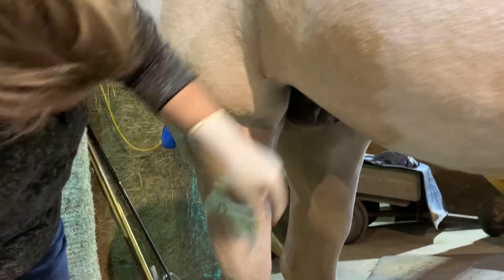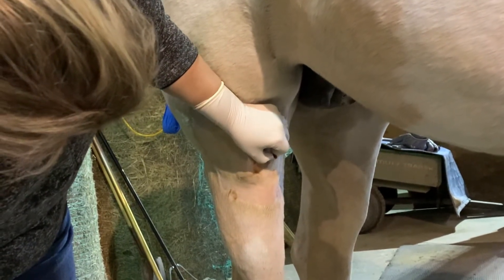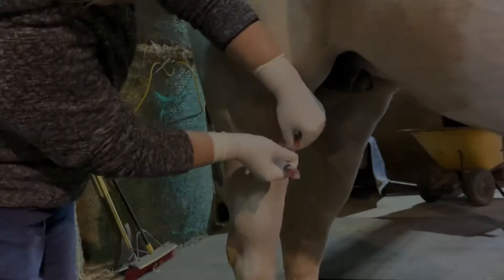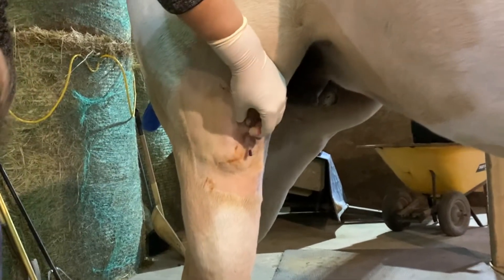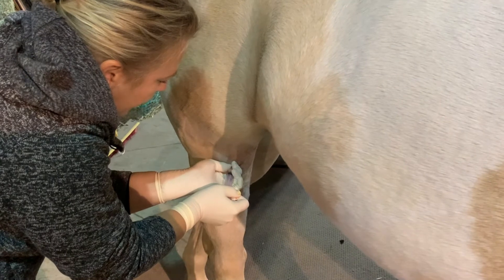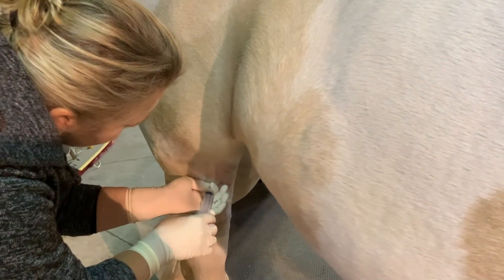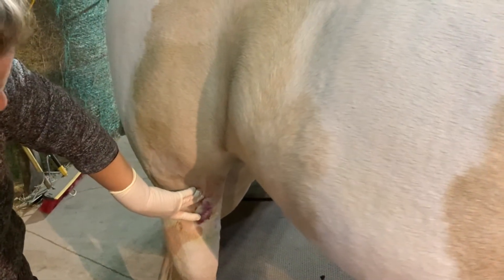The needle is one-and-a-half inches. This is an injury horse, and I'm actually getting a little bit of hemarthrosis. I'll check to see if I have joint fluid. I'm trying to open up that joint a little bit more because I know I have some problems with it — an arthritic joint is usually a little bit clearer than this. I always stabilize that needle, even when I screw it on, to make sure I don't have any leakage — and if the horse kicks, I can hold that needle. I can actually feel the crepitus in this horse's joint; she has so much damage in there.